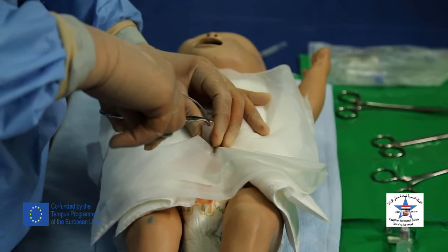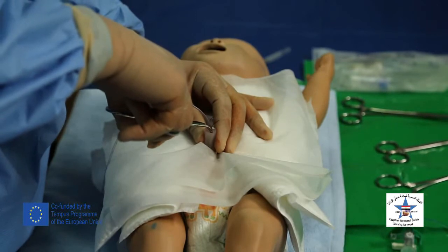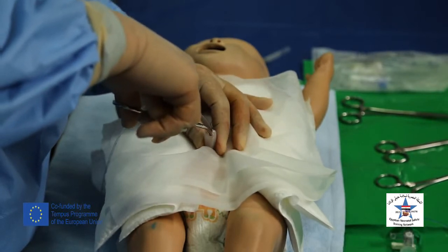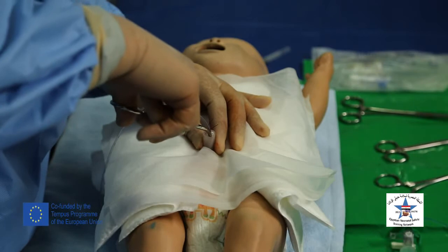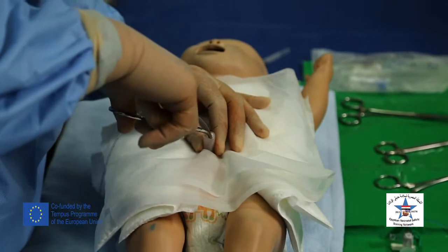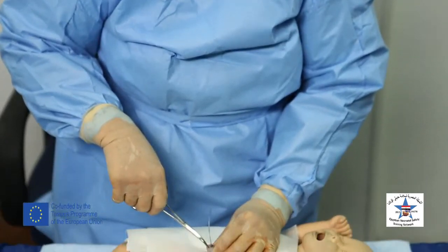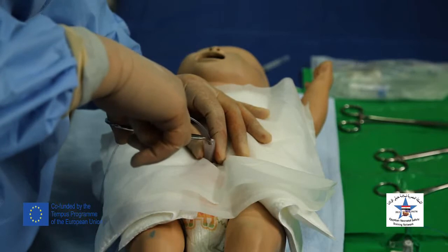With the tip of the forceps, apply slight and steady pressure at the tip of the umbilical artery and open the tip slightly, and then close and apply. Go a little bit deeper and apply pressure again and open the tip of the forceps again, and so on until a distance of around 1 centimeter. You may encounter resistance during the entrance. We need to wait for a few seconds until the spasm in the artery fades, and then try again.